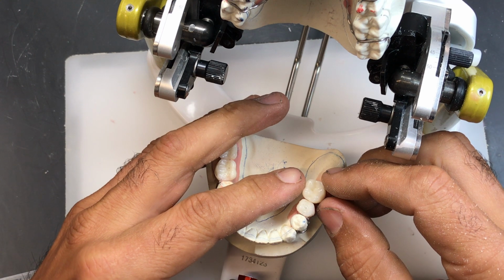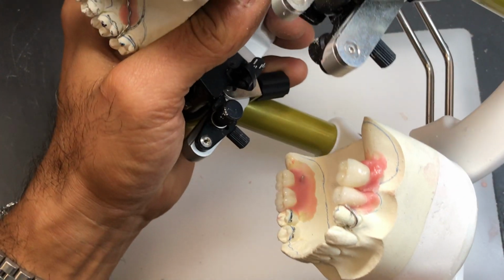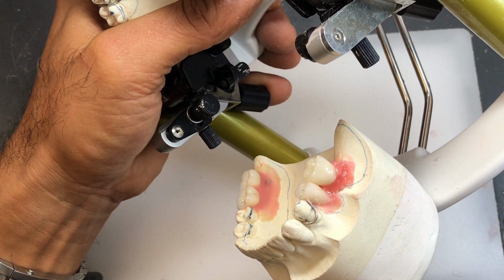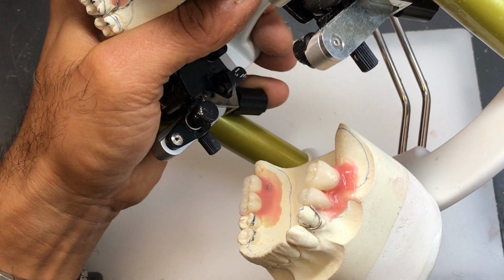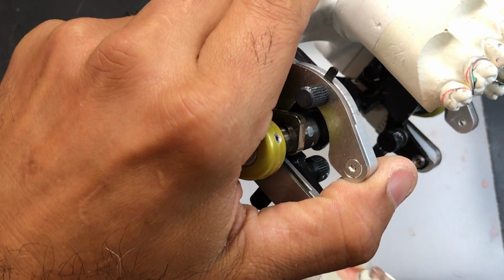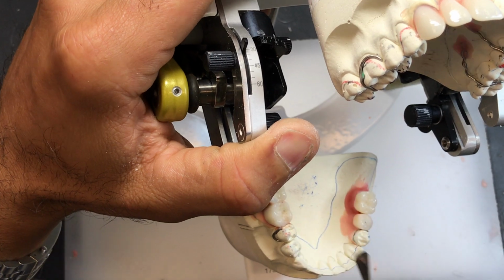A little bit high, push it down a bit, just judging by the marginal ridges and by the central fossas, something like that. Maybe correct, maybe not. We'll see in a second. The opposing will tell us. So I'm going to seal this down. And a little bit on the lingual side to ensure that the tooth doesn't move. Bit in here. Just going to air chill that for a sec.